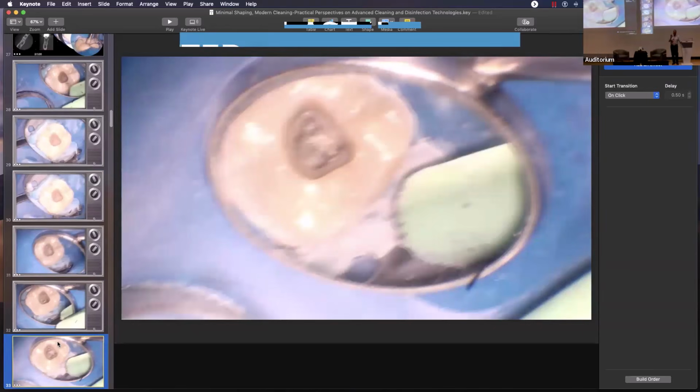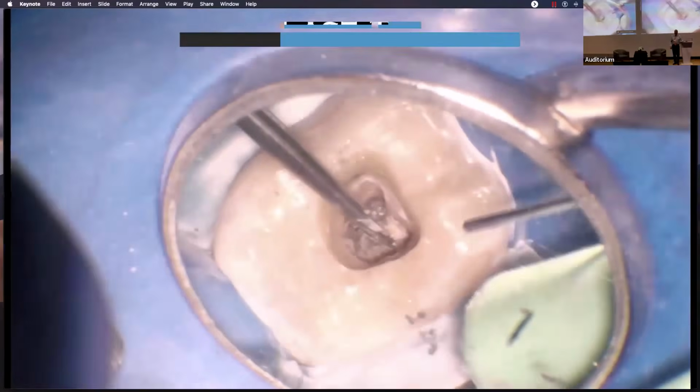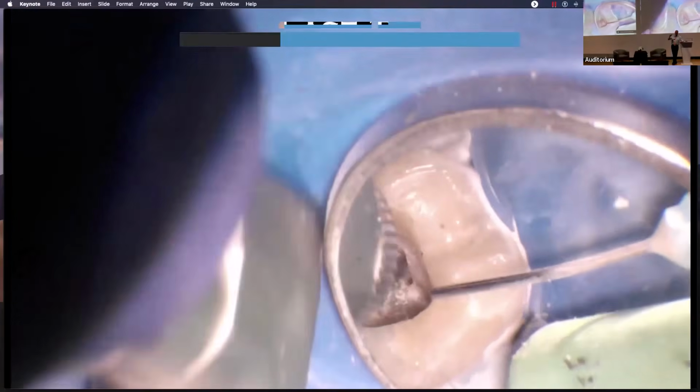That's what helps a little bit from dinging up the access too much on the way in. I said clean that up with an LA access. I'm in an endo guide, so this is the EG2. The EG2 is a workhorse. You can really wrench on this thing, you can really lean on it. This is going to knock stones off, and denticles and chips along the wall, and smooth things off so it's easier to get your rotaries in. We're kind of working through the stone.